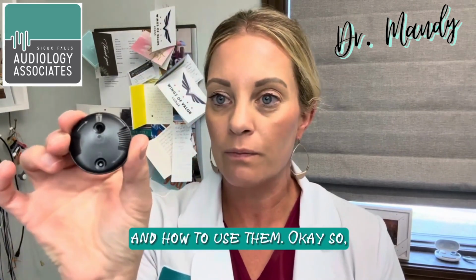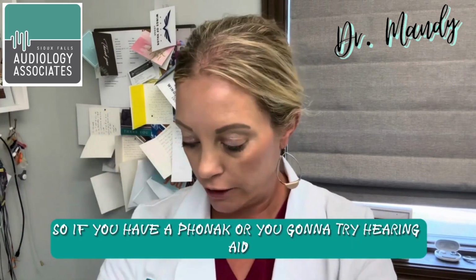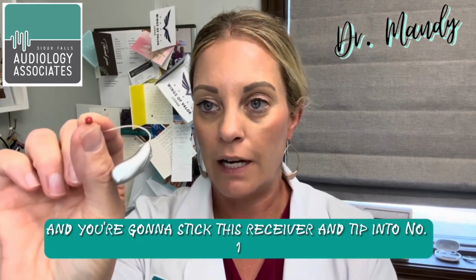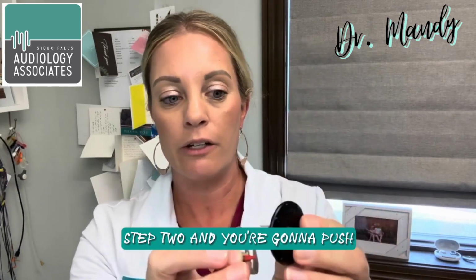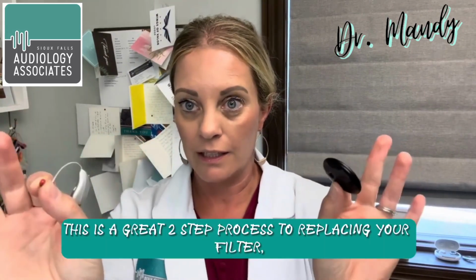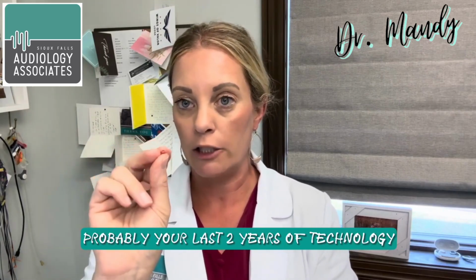Okay, so we have a two-step process. Number one is garbage. Number two has the new filter. So if you have a Phonak or a Unitron hearing aid, this is what you're going to do. You're going to pull off your rubber piece and you're going to stick this receiver end tip into number one, and it's going to snap. So you're going to push, you'll feel it, and you're going to pull out the old filter. Then you're going to go into number two, step two, and you're going to push, it'll snap, and there's your new filter. This is a great two-step process to replacing your filter, aka wax trap, with Unitron and Phonak hearing aids. These are going to be probably your last 2 years of technology.